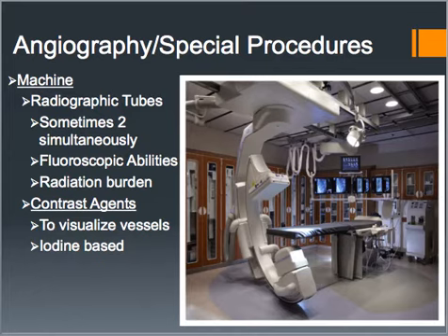Typically, the patient's given what we call conscious sedation, so they're relaxed but they're awake. A lot of times we call it an amnesia drug because the patients might not remember everything during that time, but they're going to be awake the whole time. They just won't remember it. Like I said earlier, some procedures can take 2 hours and some can take less than an hour. It's just going to depend on the level of difficulty, what they're trying to look at, what they find when they get in there.